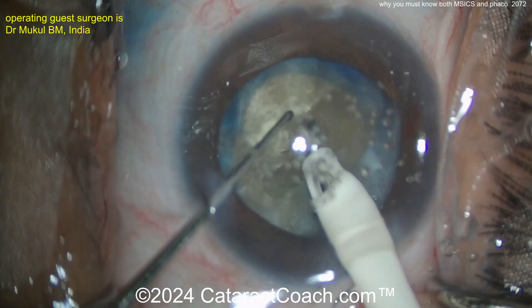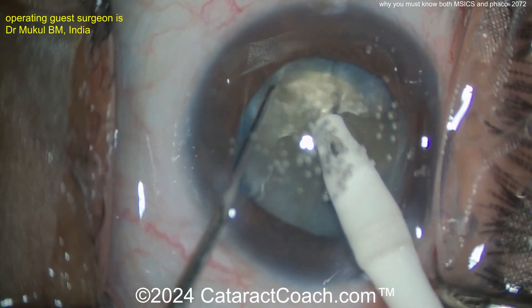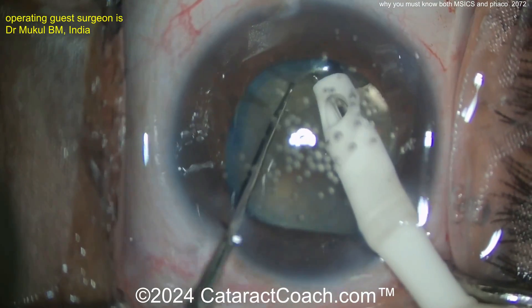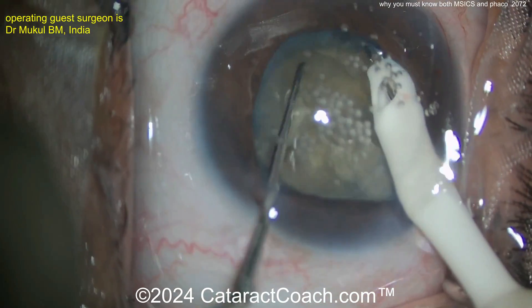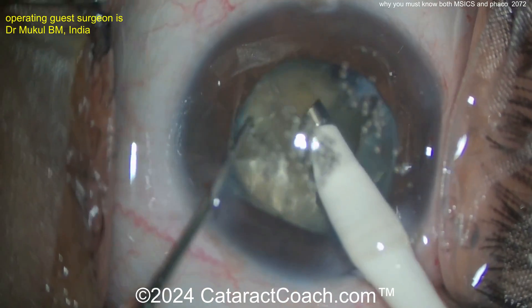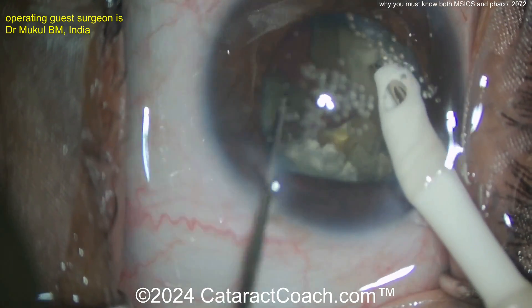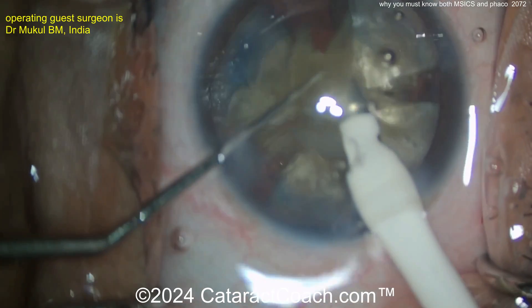Here's the phaco probe going inside the eye, buzzing with the phaco tip. Maybe a groove down the middle — let's see the groove. I'm watching the video for the first time with you, and there we go — almost a chop, yeah, there's a little chop, and you get that nucleus split up. In a case like this with a highly myopic patient, you don't want that big incision, you don't want the eye hypotensive for any period of time, you don't want traction on the vitreous base, the sclera could be thinner, and with a narrow palpebral fissure you won't have as much exposure. It was tough to chop — a little fibrous posterior plate, so maybe a little denser than we thought. Using the phaco probe you can aspirate that pretty easily. Recoating with viscoelastic is a smart move, and now these pieces come down to the phaco tip pretty easily.